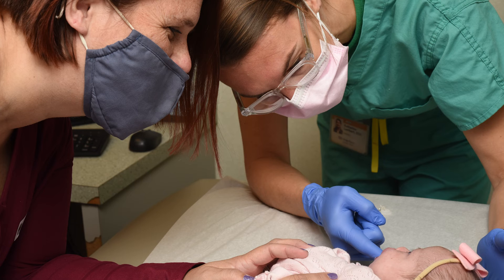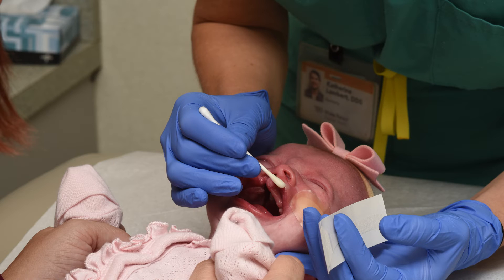We help show the families how to take care of the appliance as well, and to change the tape, so we all work together as a team. We first clean the skin and the gums prior to inserting the appliance, and then the NAM is held in place through small rubber bands that are taped to the cheeks.